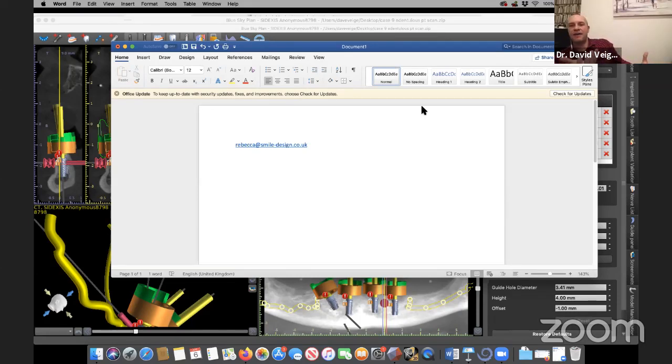I don't have one of those, so I put a 2mm healing cap on and take a round burr and smooth the bone off on the distal. That's how I deal with the distal portion of the bone. Or use a cover screw or something to protect the head of the implant from the burr, and just be very careful.